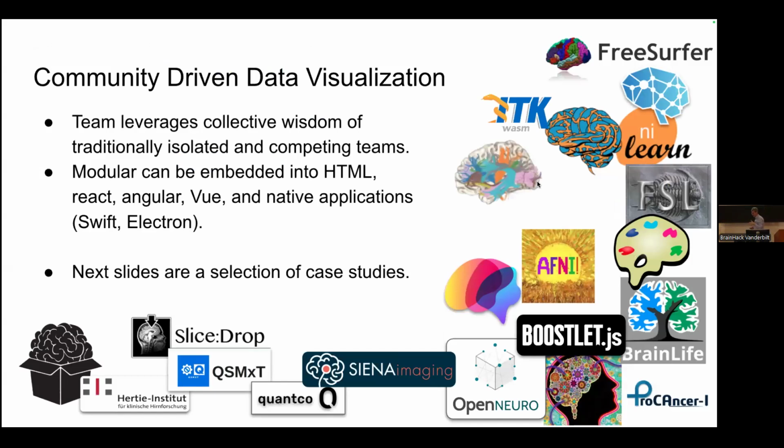And so my sense is this is kind of a step time where we as a community can work together and say, what are common visualization tools? How do we solve all of our problems in our formats? And so we've tried to create a tool that's already been adopted by quite a few of the different popular tools in our field that tries to solve this problem using web technologies to provide a very simple modular solution.